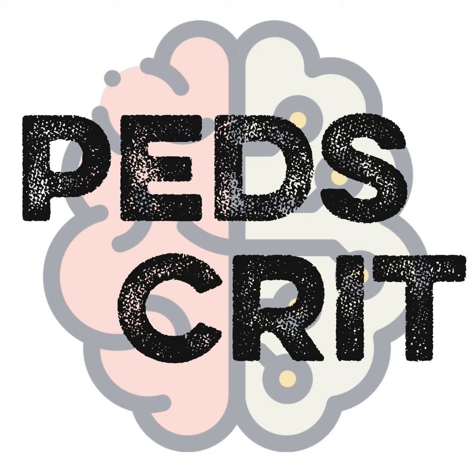So I think in a VA ECMO, the sequence of events that can happen is that VA ECMO actually increases your afterload and your aortic root pressure, right? So this in turn, if it's combined with some degree of aortic valve incompetency, right? That's why I think the important question we ask is, what is your pulse pressure? And then the echo, we serially look at whether your aortic valve opens or not. Some degree of aortic valve incompetence in combination with increased LV afterload, since you go on ECMO, actually leads to some degree of LV distension.